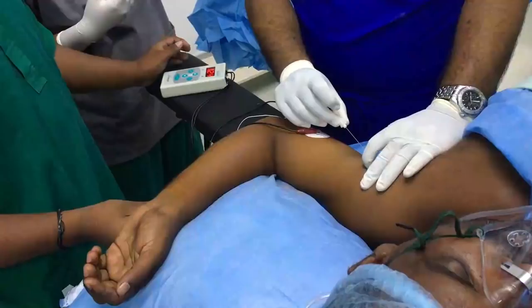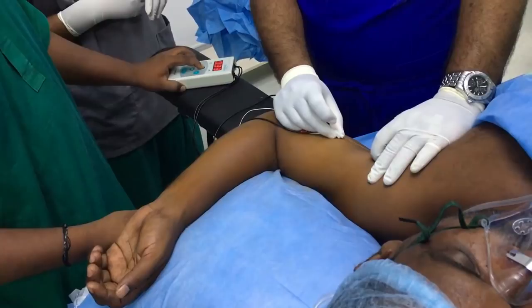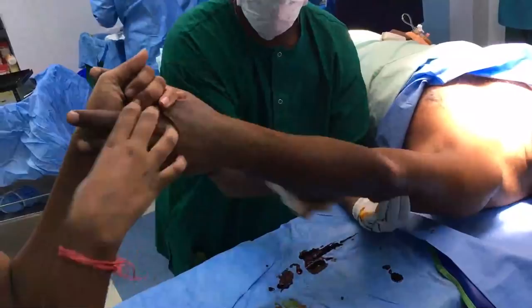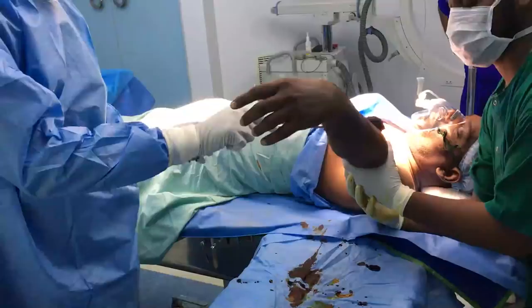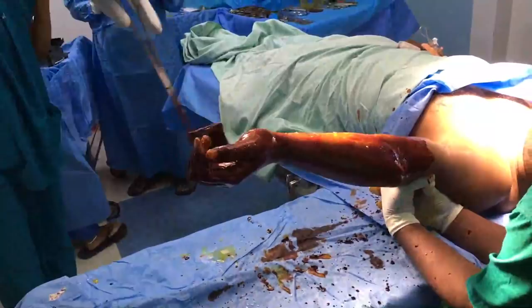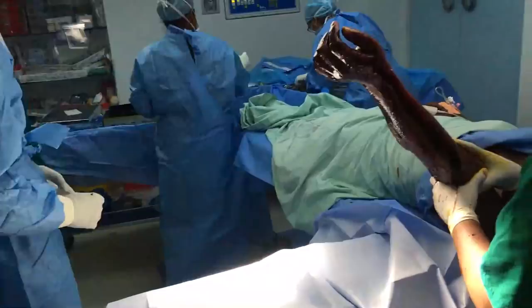The patient is operated under regional anaesthesia. A nerve stimulator locates the right area of the axillary neurovascular bundle where the local anaesthetic is injected. The patient is otherwise mildly sedated. A pre-scrub is given to the forearm, and during the actual scrub, the arm is held beyond the elbow with the palm, hand and fingers free. The limb is cleaned and draped in the standard manner.